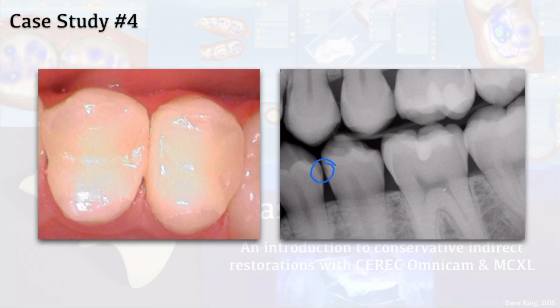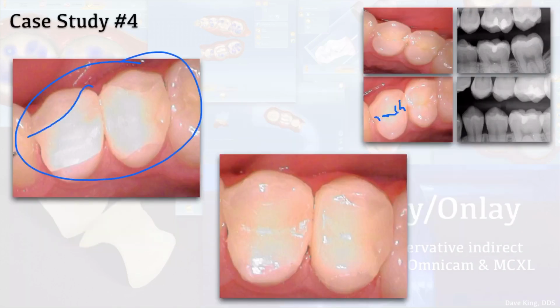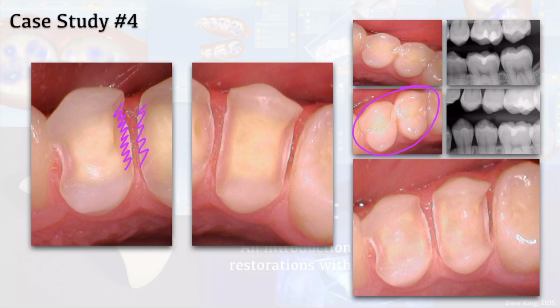I told them we'd monitor these other areas, take a look. I didn't really see anything intraorally on that spot when we had them opened up. Let's go back here. Yeah, you can see a little whiteness, but it's not nearly as concerning as the other spots were.